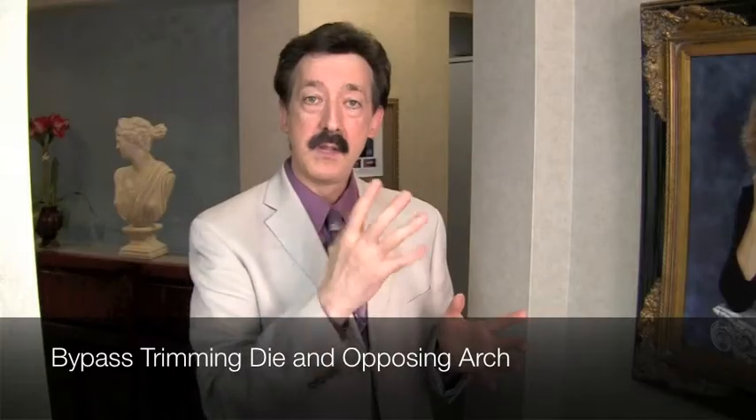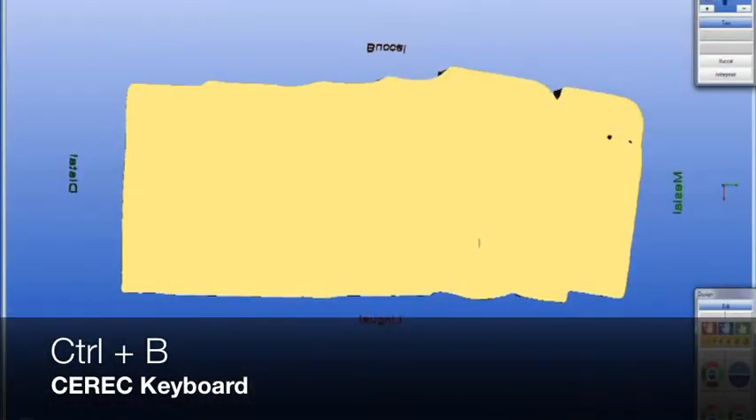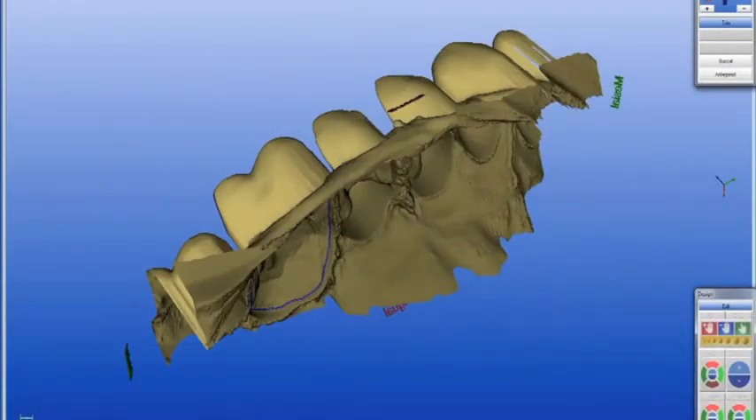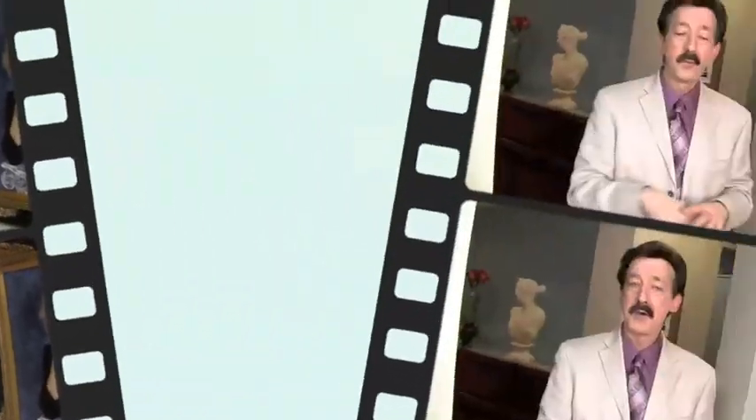My first responsibility after correlation is outlining my margins. Here's another secret: when you're outlining your margins, since I don't trim my virtual die, hit Ctrl+B on your keypad in your margin screen and then flip over your die underneath. It looks like an impression that you would have taken with your traditional impression materials, and you can precisely see your margins. So if you want to highlight or retrace any margins to make them nice and clean, that's the best view for me.